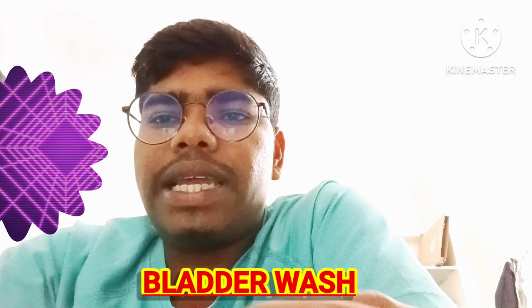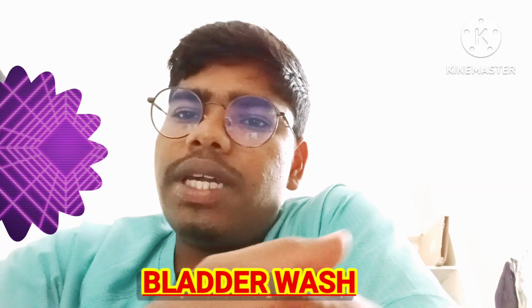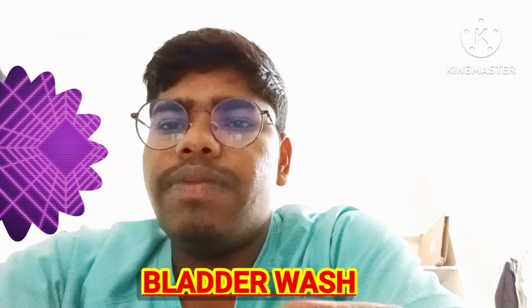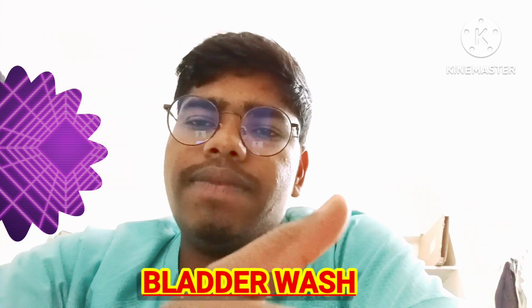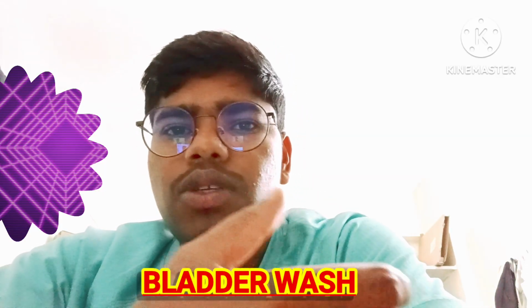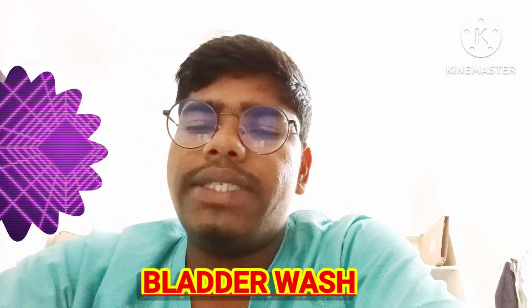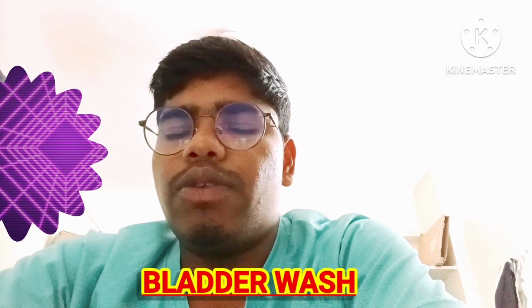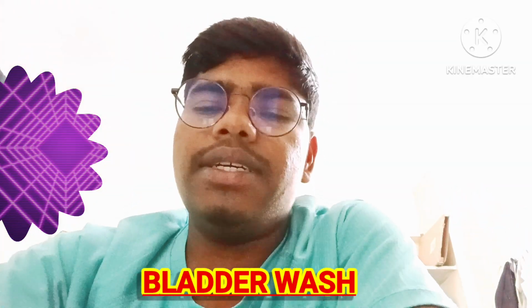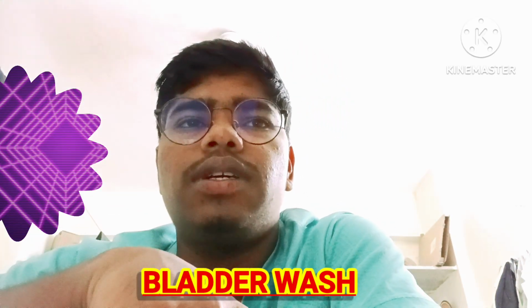So now again, what do we do? We disconnect it, and again we reconnect the urobag to that channel in the Foley's catheter, and now again we drain it in the same way. When we drain the urine, exactly the same way we drain the liquid that we used for bladder wash. So whatever we used earlier will be drained out by the Foley's catheter into the urobag, and this is how you do the bladder wash. It's a very easy procedure and very effective in preventing and treating cystitis. Okay, so this is how we perform the bladder wash.